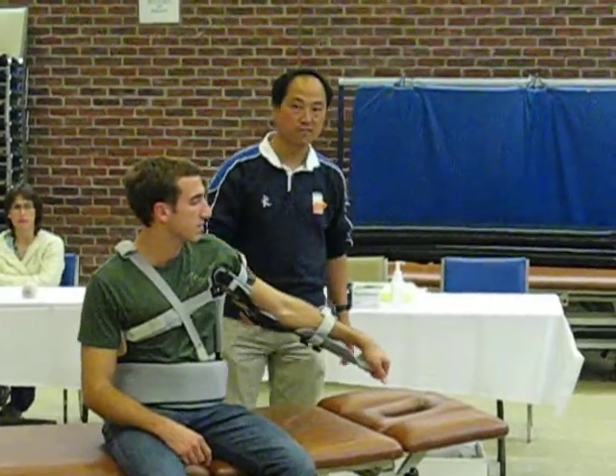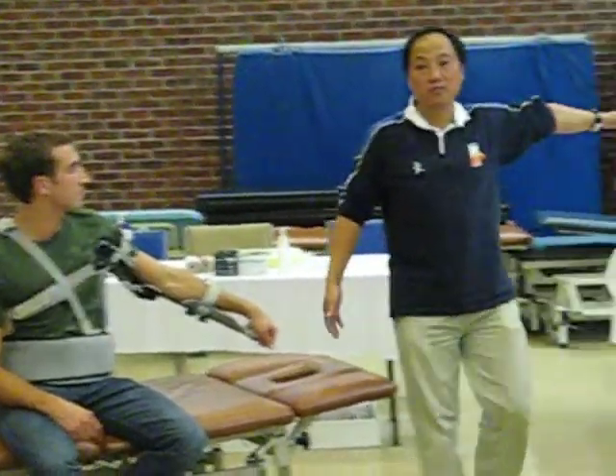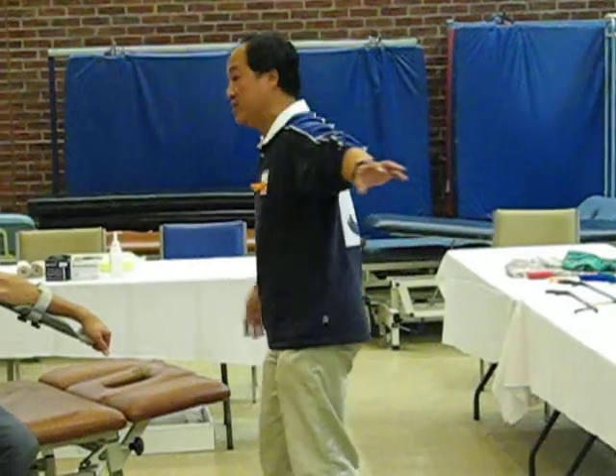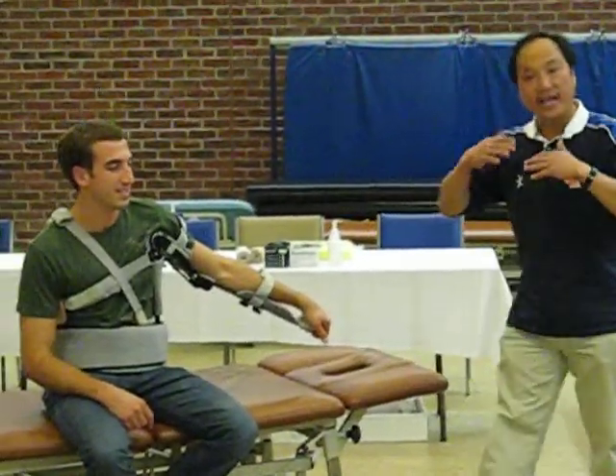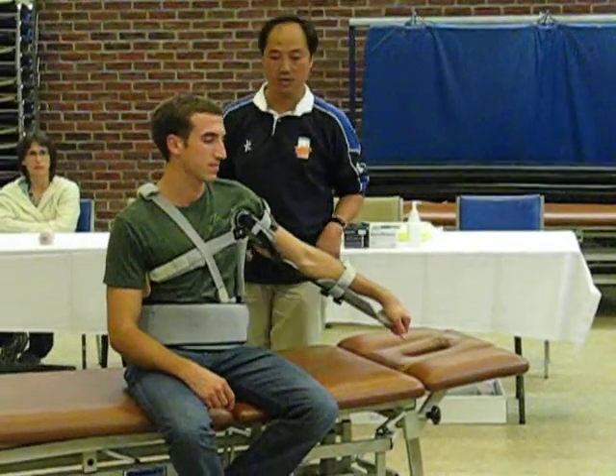It depends, though — they may not have the room to let you move it fully, so you have to compromise. Or maybe you have to teach the patient to walk a certain way. Ideally that's the way, but you have to compromise according to the environment limitations.